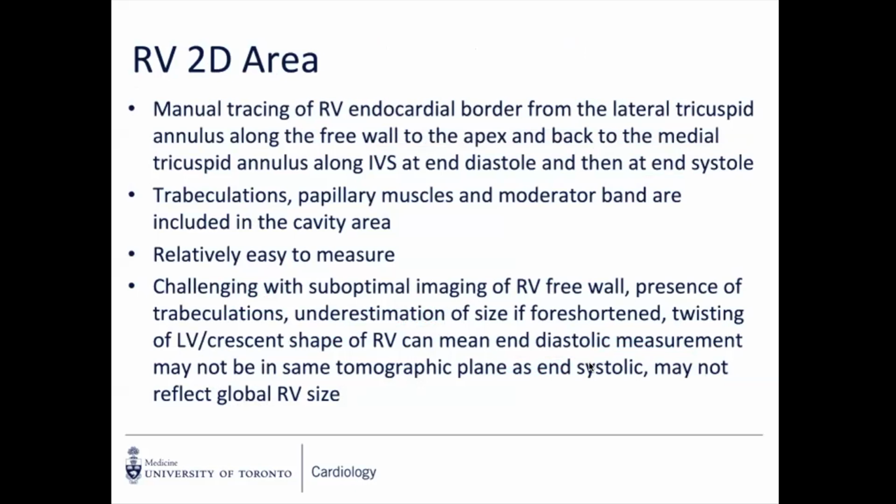Another thing is that because of the nature of the interaction between the LV and the RV, your diastolic measurement may have to happen in a different tomographic plane than your systolic measurement. So that's another important feature to remember: you may have to fan a bit differently to be able to get a good systolic measurement, because depending on how the LV is contracting, it may completely obscure the RV.